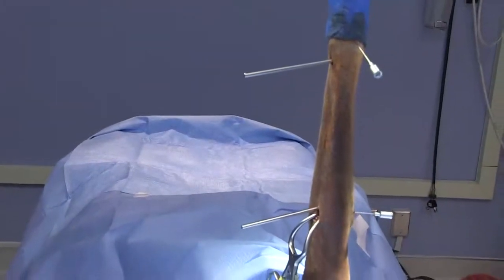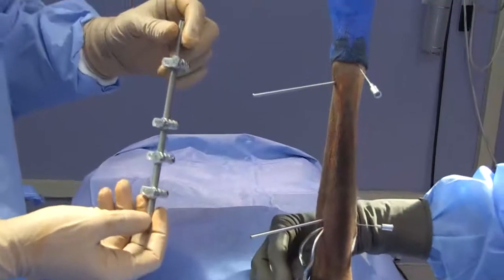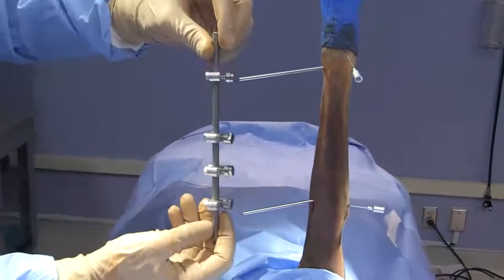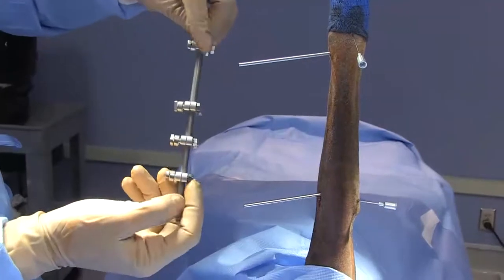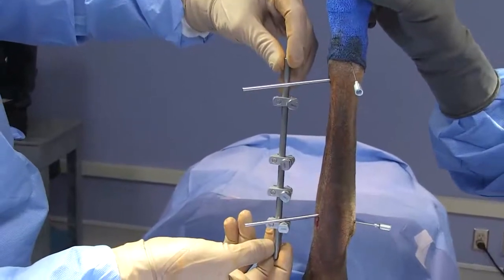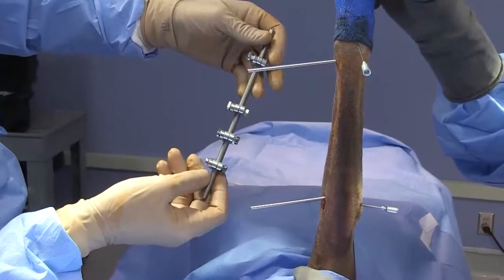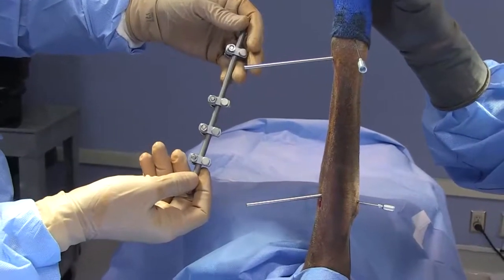Next we get our connecting rod and of course make sure it's of appropriate length. The optimal connecting rod is one that basically allows you to get your most proximal and distal pins engaged into the clamps. This connecting rod right here is a suitable fit. Going much larger than needed adds extra bulk on the apparatus that the dog might have to deal with — so just avoid that.